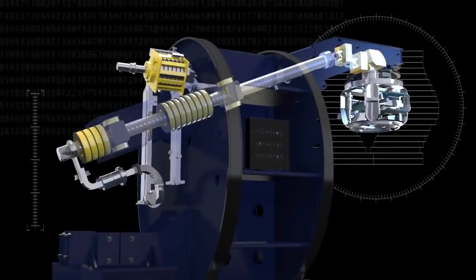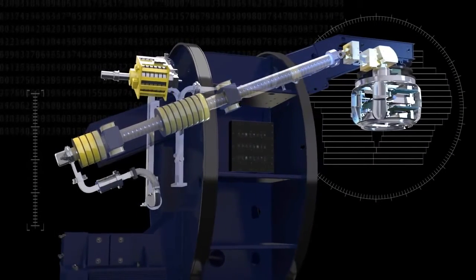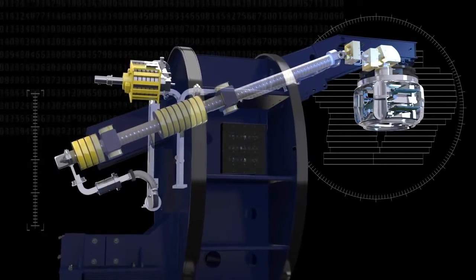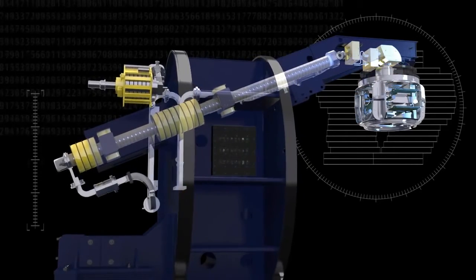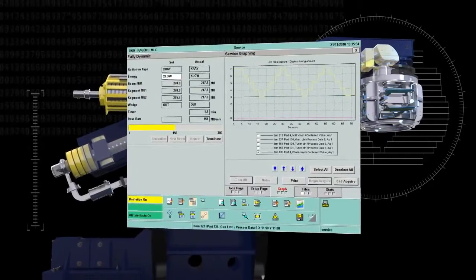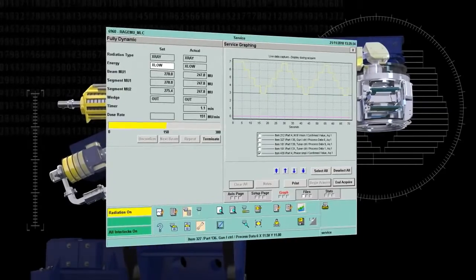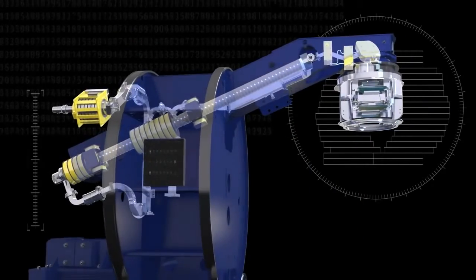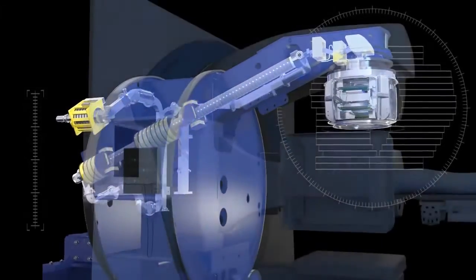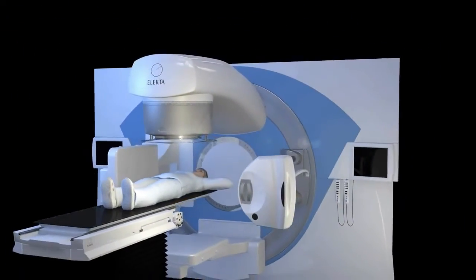All electromagnets, steering and focusing coils are digitally controlled. All mechanical positions of flight tube filters and foils are automatically selected from the control console and all radiation beam settings are grouped in calibration blocks for each energy. These are stored digitally on the LINAC hard disk for flexible and easy beam adjustment, calibration and servicing.